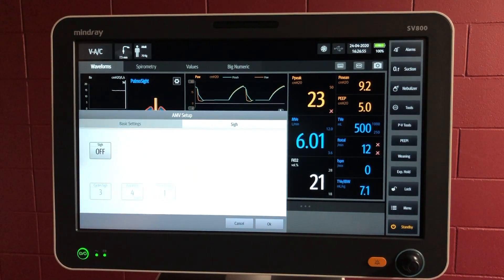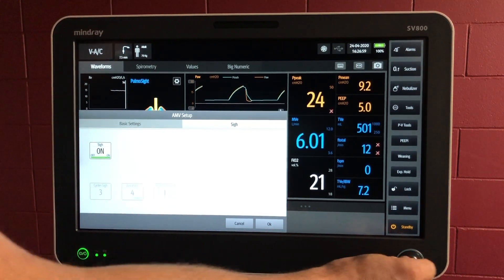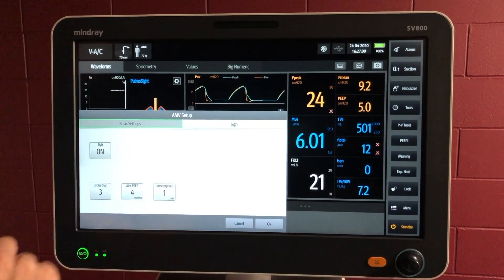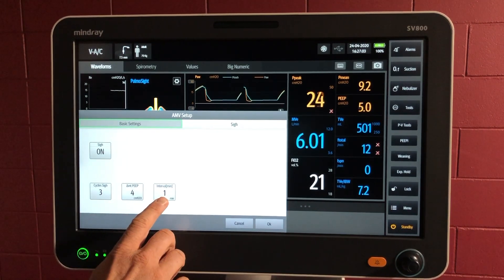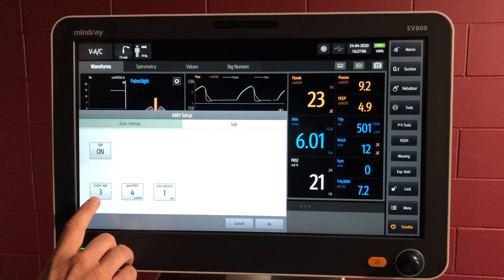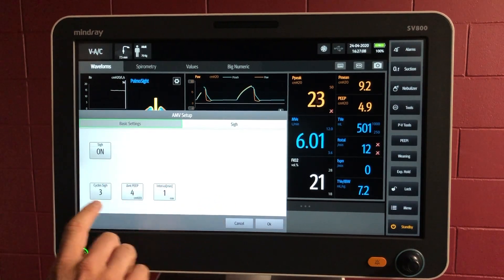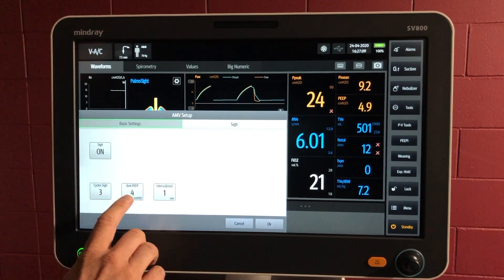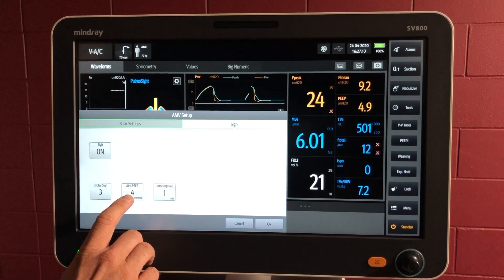There's a sigh function available and we can turn that on. You can set it to go through every minute — in this case three cycles, three breaths of sigh — with an increased PEEP for that time to open up those airways.